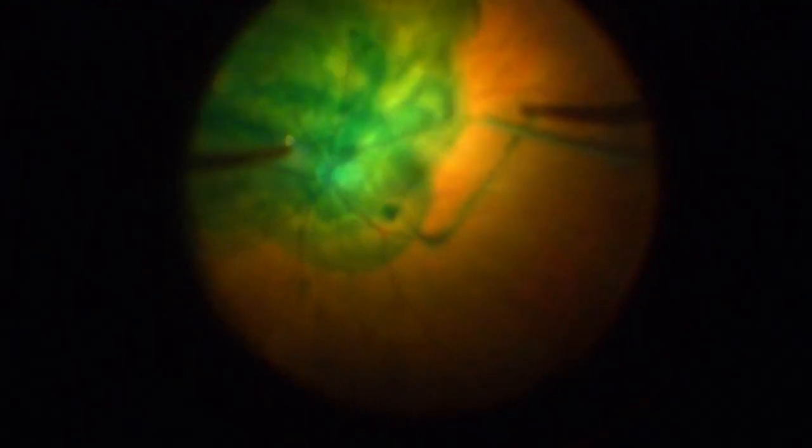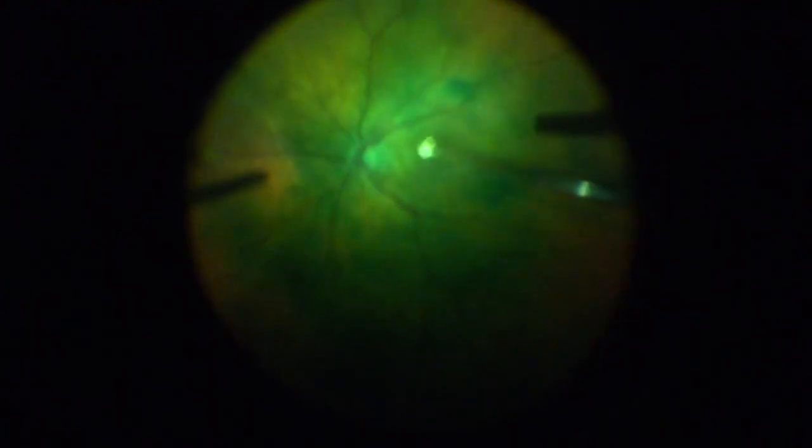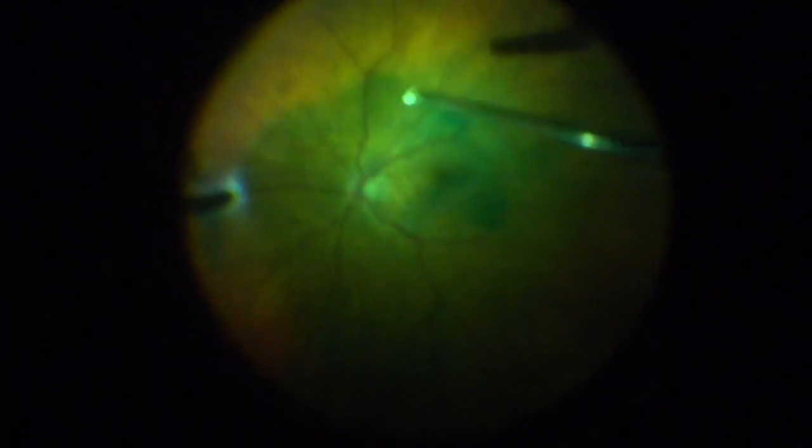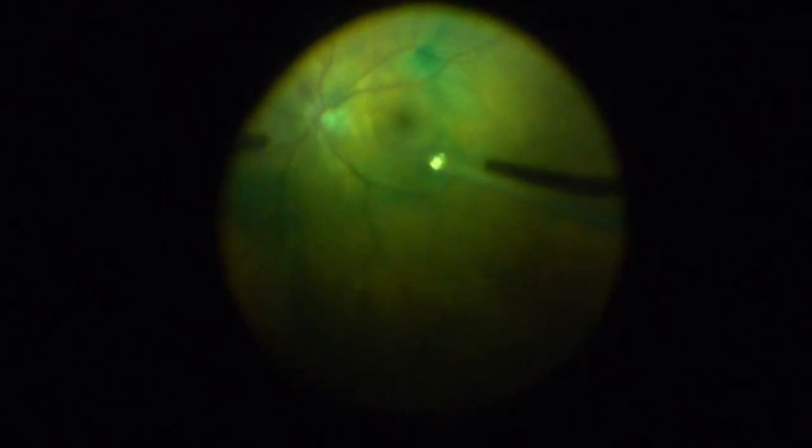Now, that's enough there. Look how, when I put this in, I'll definitely avoid the center of the macula. One more right there. I avoid the center of the macula just in case there was a macular hole here, or some of the dye inadvertently goes subretinal through a really hard push. We don't want that dye being under the center of the macula. So I put it in under the wet technique, meaning we don't drain the eye out. I find that to be quite adequate, and it saves a step.